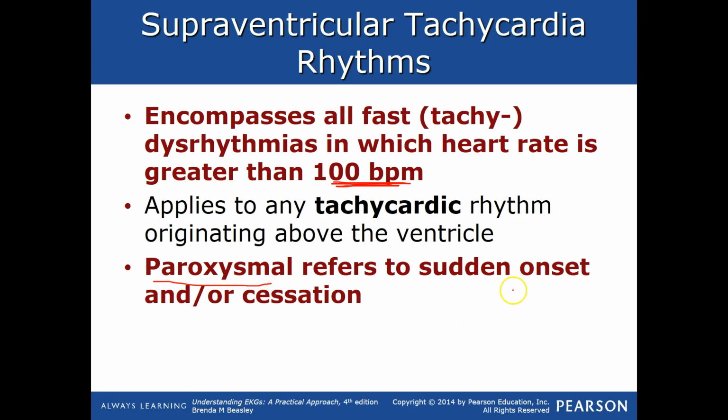It refers to the sudden onset and/or cessation. So you were watching them, and they were in a normal sinus rhythm or even sinus tach, and they went into SVT, or it stopped in front of you. Or sometimes, they were just sitting there, and then this suddenly began, and they weren't necessarily hooked up to the monitor, but that's what paroxysmal is. It was just referred to as sudden onset.